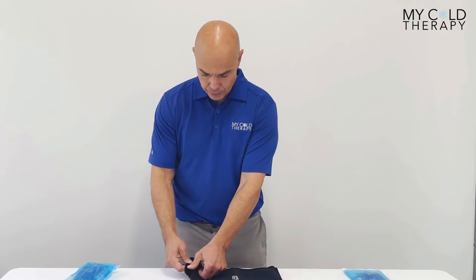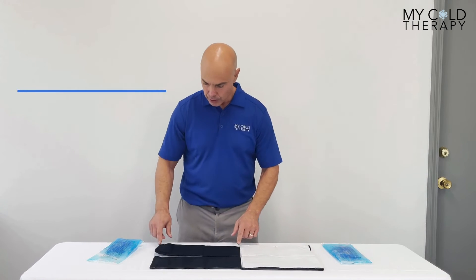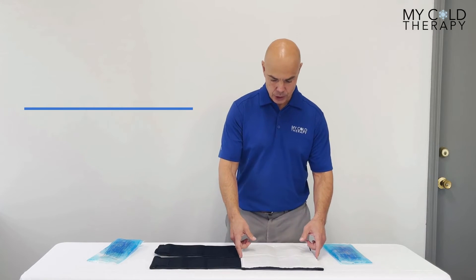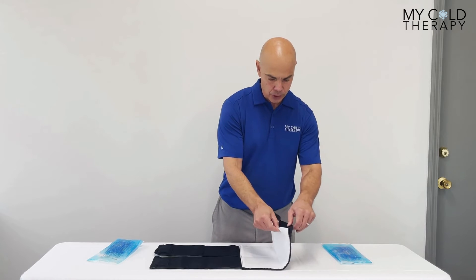The wrap itself comes with two straps, as you can see here, and they're full compression straps. They are 13 and a half inches long by 6 inches wide. The wrap itself is 12 inches by 12 inches. The gel packs go inside in the pouches.